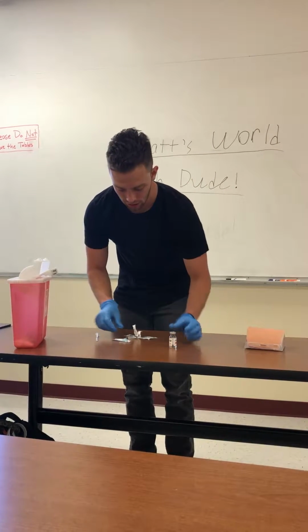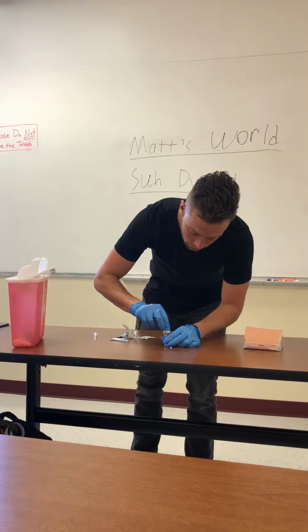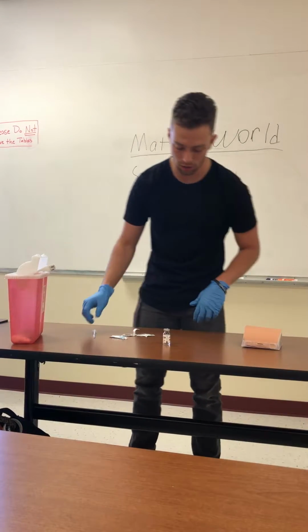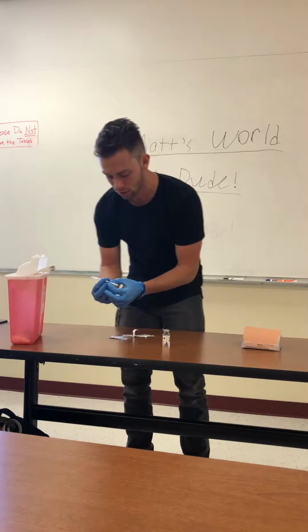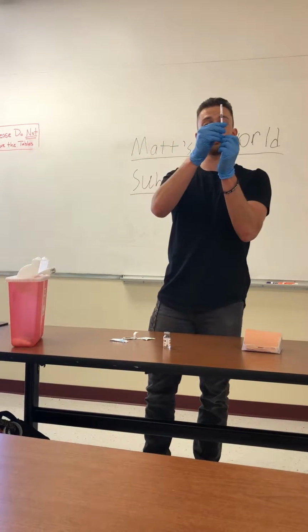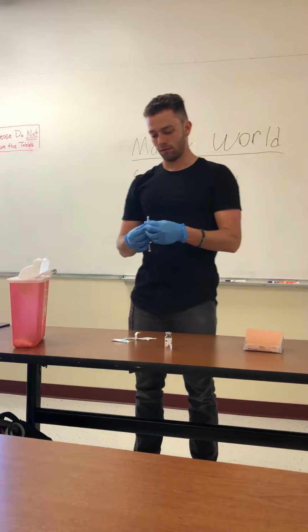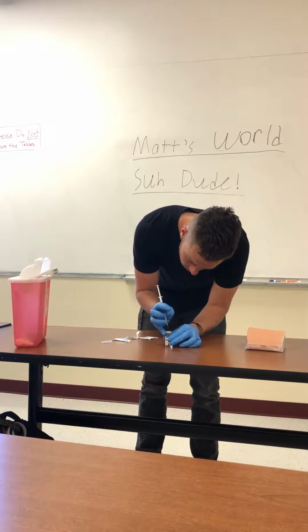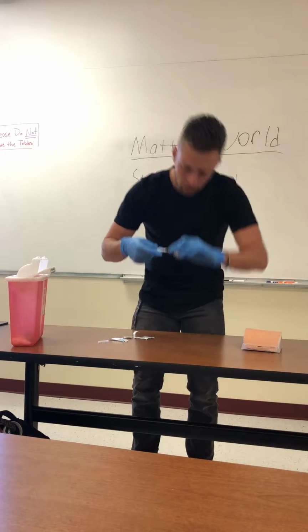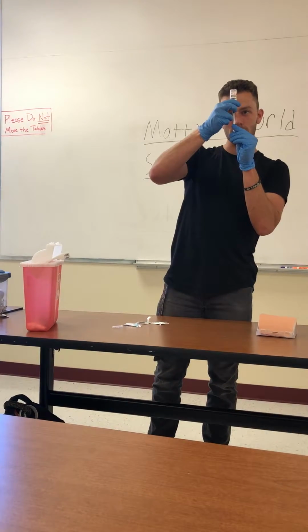What I would do first is take my vial and my alcohol pad and cleanse the top of it, dispose of my garbage, and I'm not going to touch the top of the vial again because it is sterile. Then I would take my syringe, and since I'm drawing up 0.5 milliliters, I'll draw 0.5 milliliters of air to inject into the vial, uncap my needle, and insert it into the vial, inject the air, and then turn it around and draw up 0.5 milliliters of heparin.